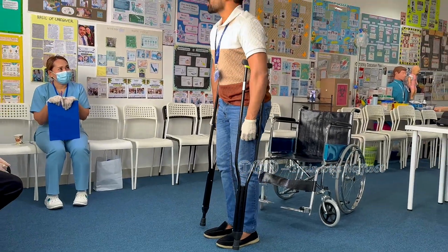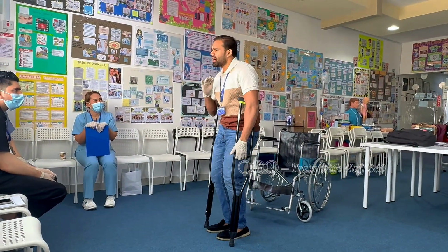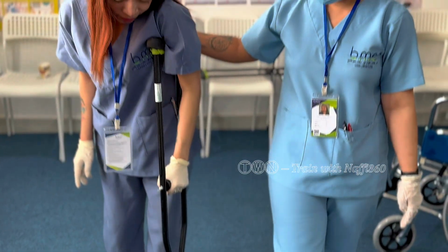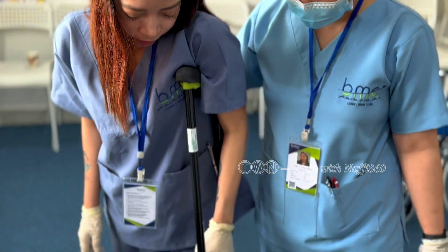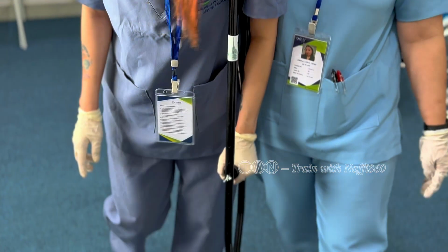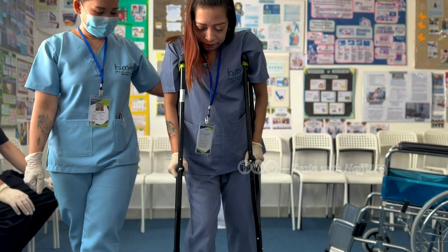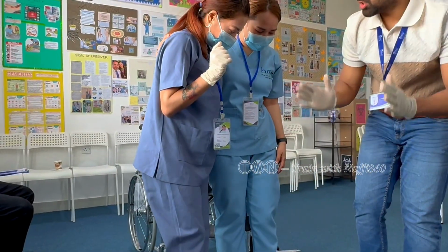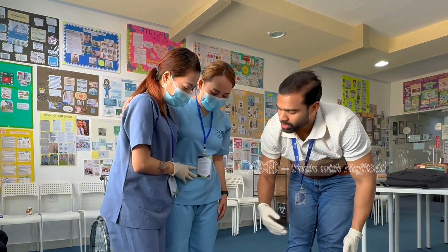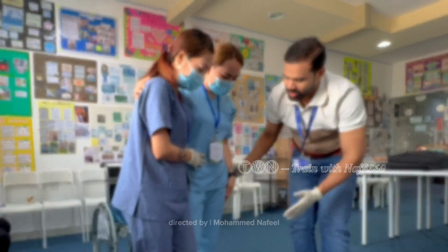After the demonstration, my students will take turns assisting and guiding the patients using the crutches, practicing safe mobility techniques, focusing on the correct posture and the correct walking pattern. During the practice, pay attention to body posture, patient communication, and safe walking pattern. This hands-on training allows my students to apply what they have learned, build confidence, and develop the essential skills required for safe patient care as nursing assistants.